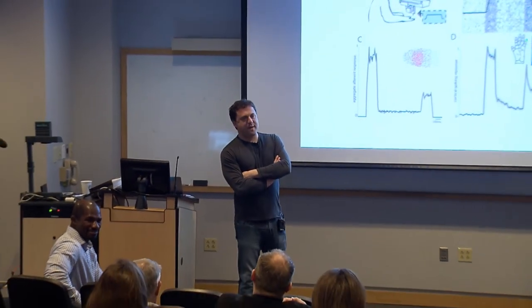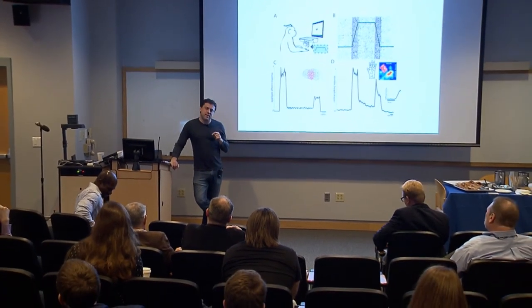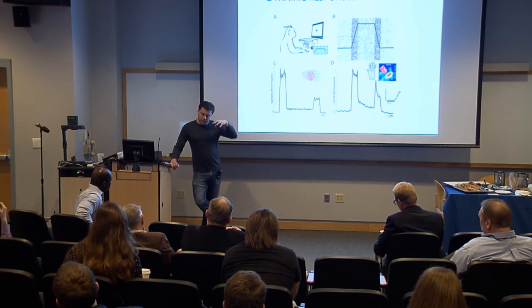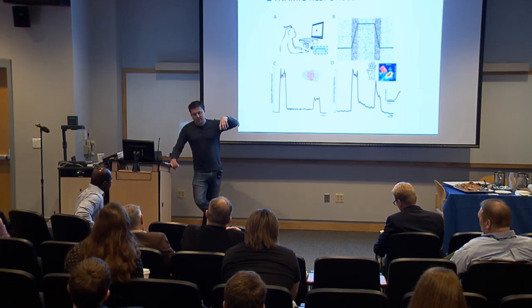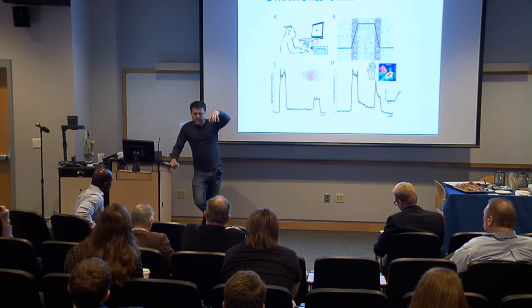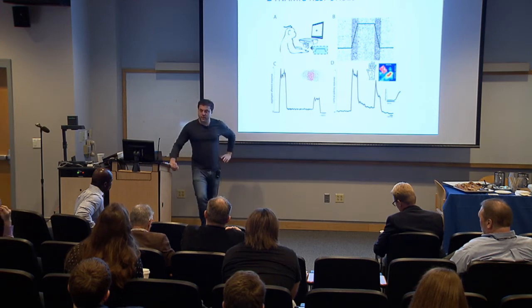Talk about what cortical layer you think you're activating. Right. So we thought a little bit about this. In area 1, with our UEAs, they're 1.5 millimeters long, so they're all subgranular, right? In 3B, though, we're straddling the bank, right? So some of these electrodes are supragranular, some of these electrodes are infragranular.